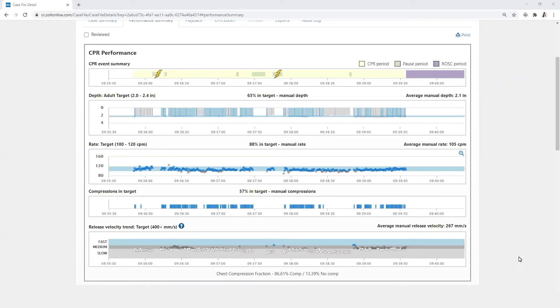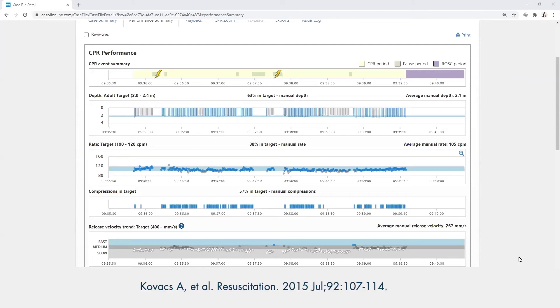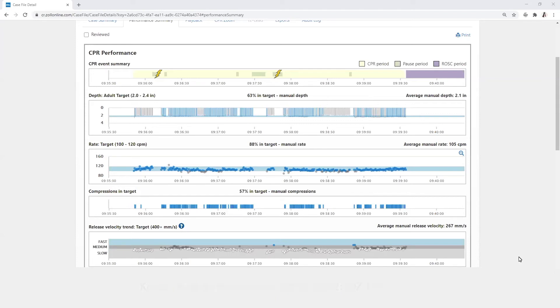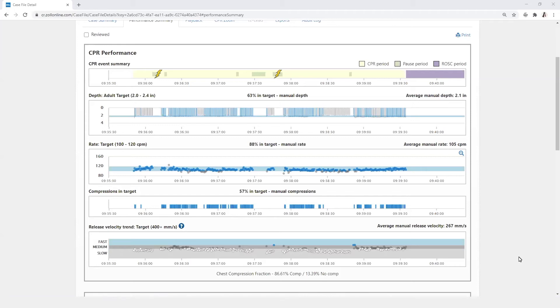In one study, a chest compression release velocity greater than 400 millimeters per second, which is defined as fast, has been associated with improved survival and favorable neurological outcomes. If ventilation data is present in the case, the ventilation charts for rate and end-tidal CO2 will be available.